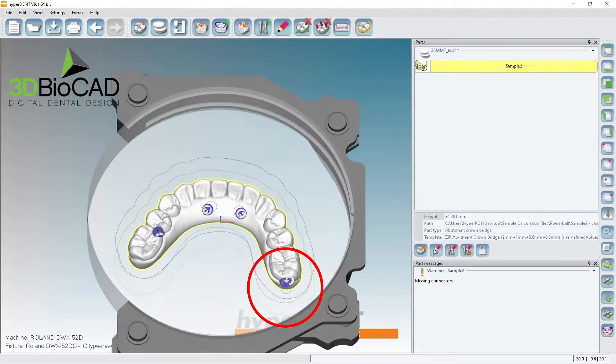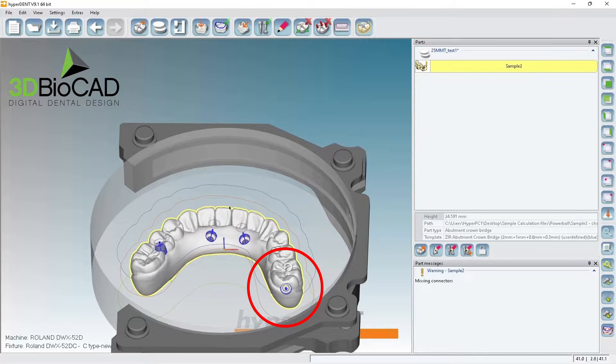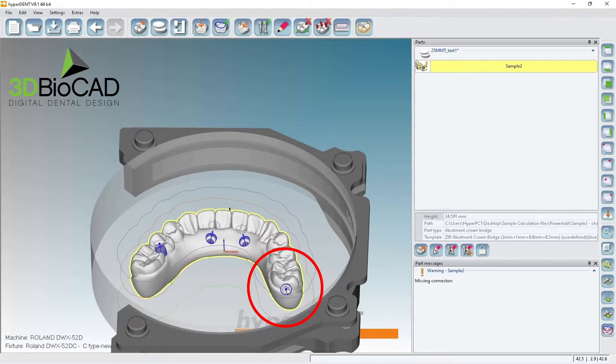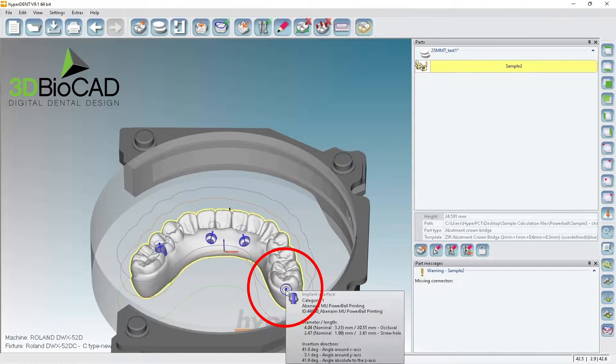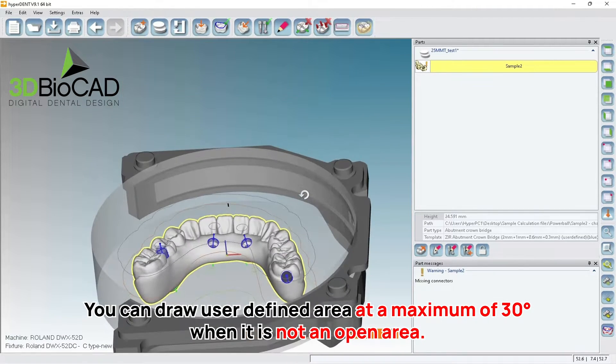If we put it here, the machine cannot tilt like this. If the machine tilts this way it will error out, or the spindle will hit it while it's milling. There's a limitation of how much I can tilt, which is 30 degrees.